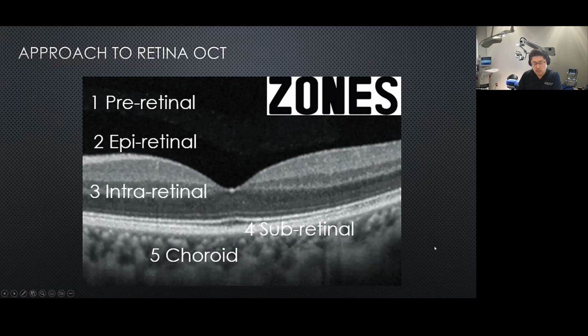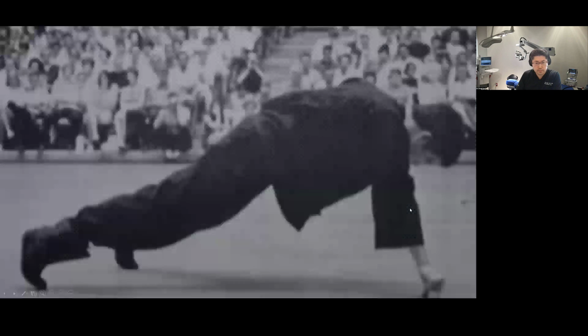Some people ask about how do you make diagnosis of retinal dystrophies? Well, often dystrophies, by the time they present, they already presented with significant atrophy, and therefore you will need multimodal imaging. And use of multimodal imaging involves the use of autofluorescence, IVFA, OCTA, OCT, multifocal ERG electrophysiology.